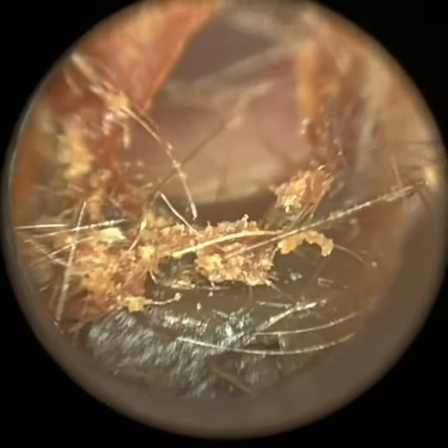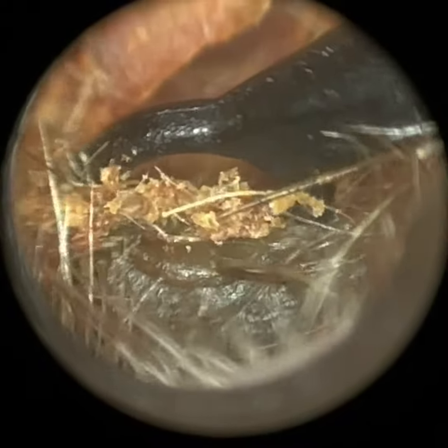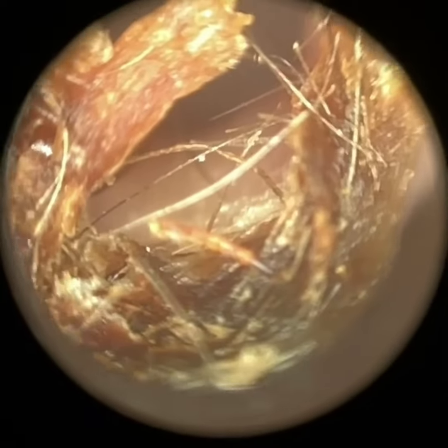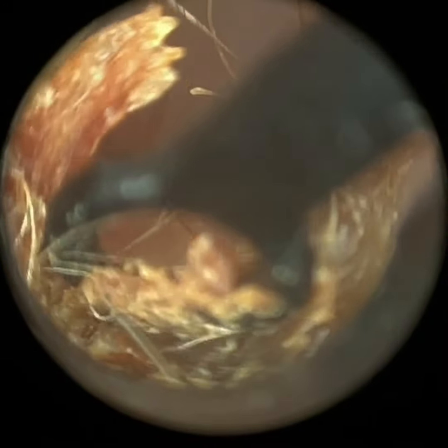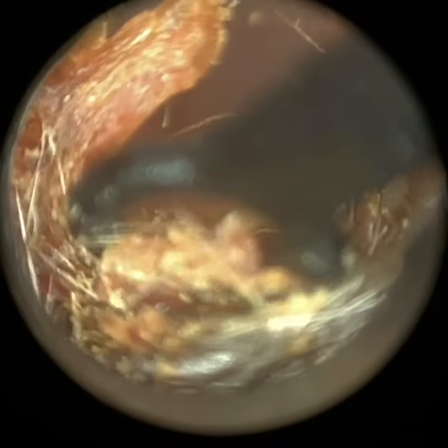However, the main reason why I'm uploading this video is not necessarily because of the procedure, because it's quite straightforward, but because this patient has long-standing exostosis, otherwise known as surfer's ear, and you'll see that in a moment. It's been seen by ENT and it's not causing any issues, so they've decided just to leave that.